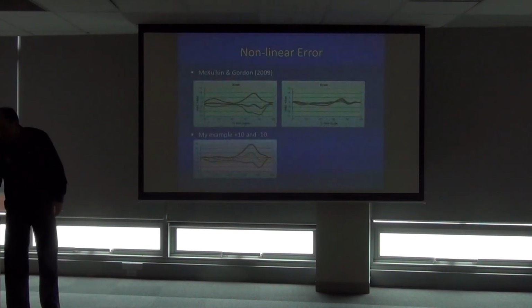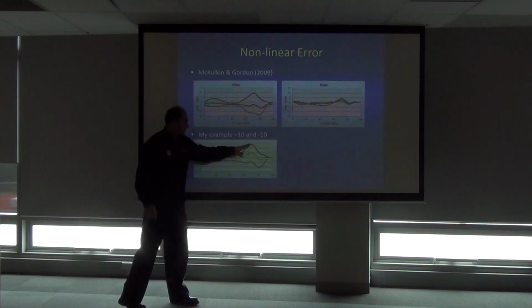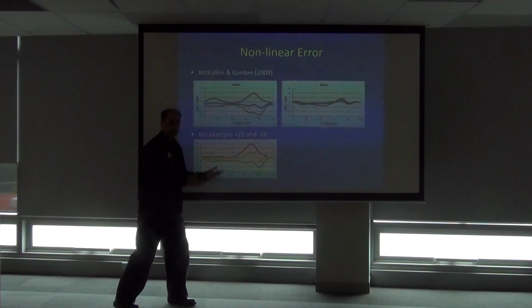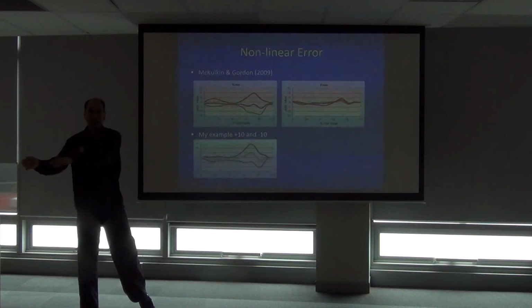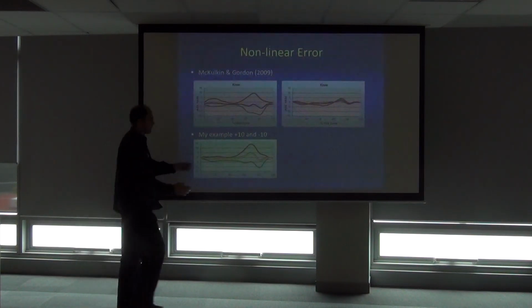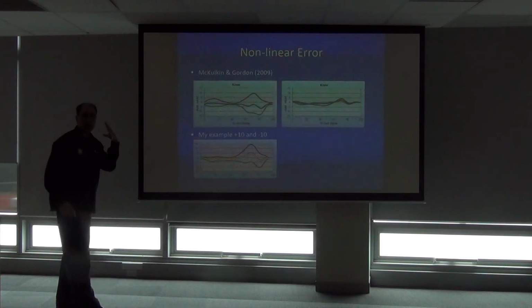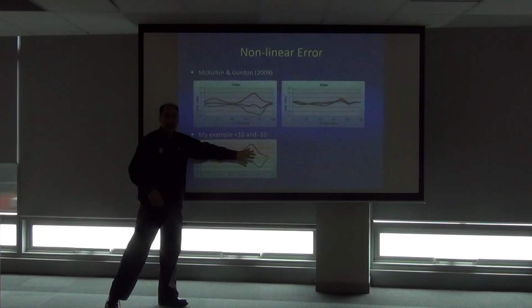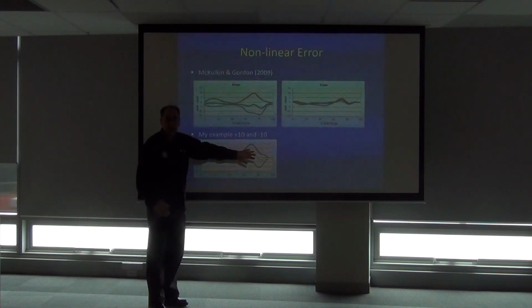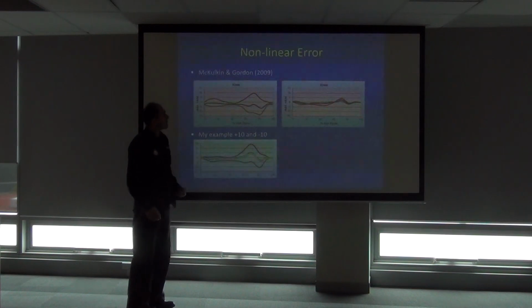Let's have a look. Here's one I just did. Erroneous data, we fed in the error, then post hoc corrected, knowing what the error was. We corrected on the proximal segment, the actual rotation of the proximal segment, which fixed the nonlinear errors that were calculated for the knee joint rotation, which is the rotation between the proximal and the distal segment.